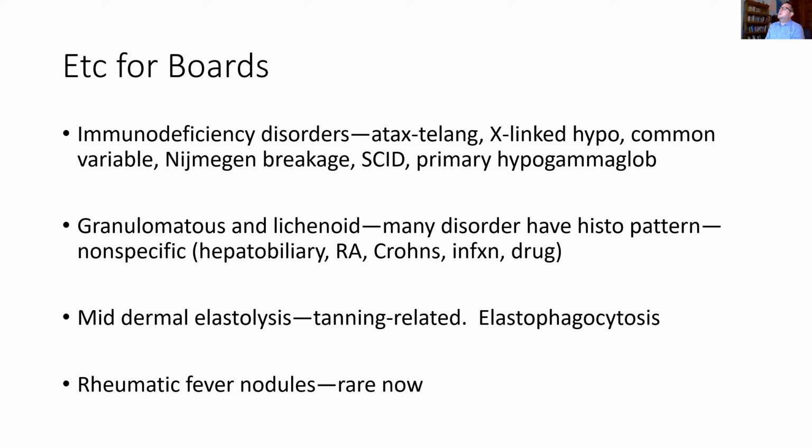Weedon has a short section on granulomatous lichenoid and says that this is a non-specific histologic pattern that can have multiple etiologies. And he lists hepatobiliary disease, rheumatoid arthritis, Crohn's, infections, and drugs. The drugs he lists for this pattern: ACE inhibitors, allopurinol, antihistamines, atenolol, cimetidine, diclofenac, and erythropoietin.